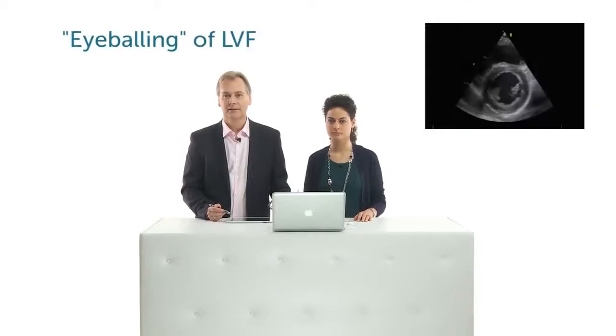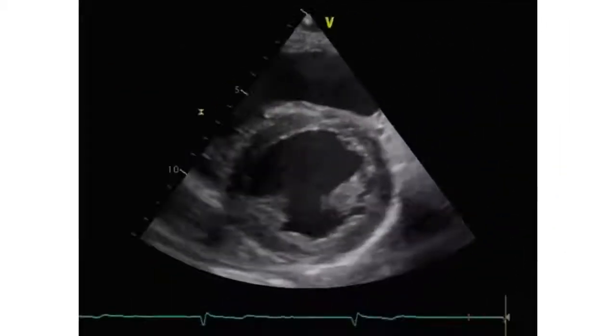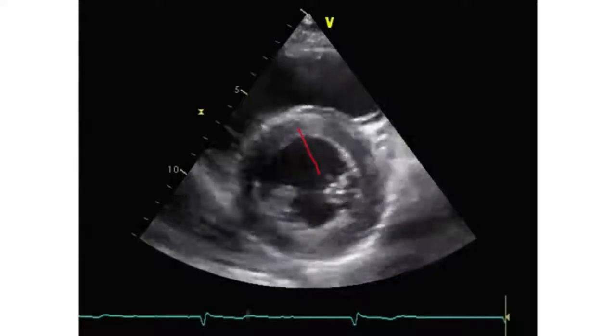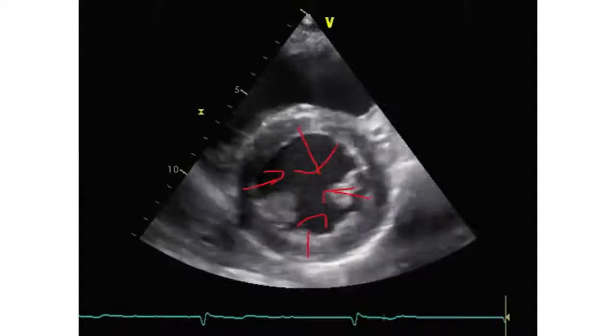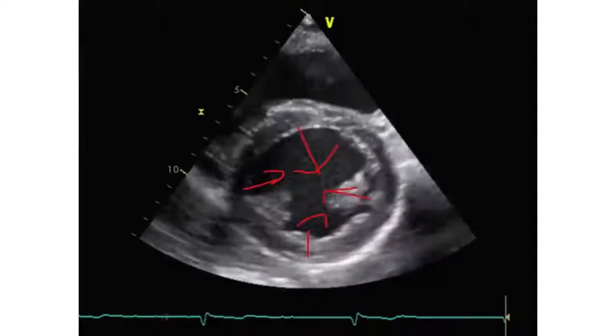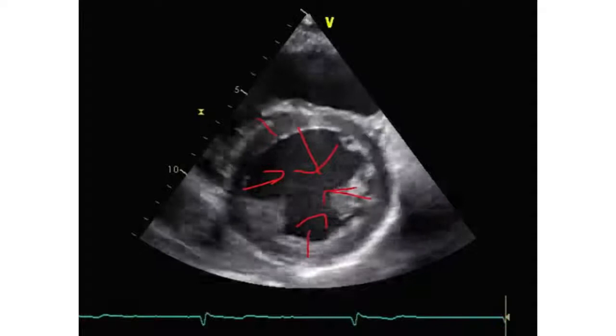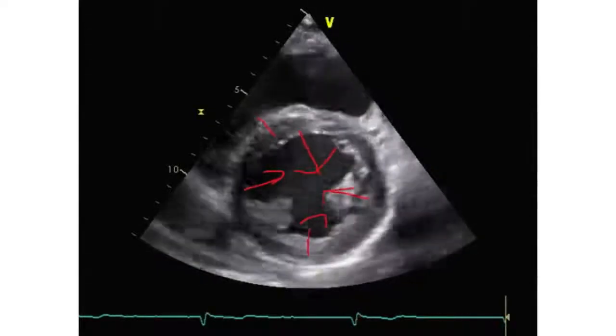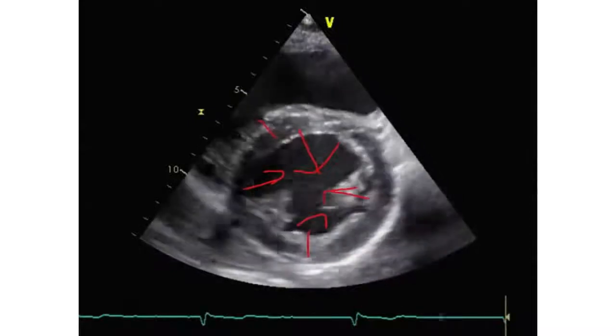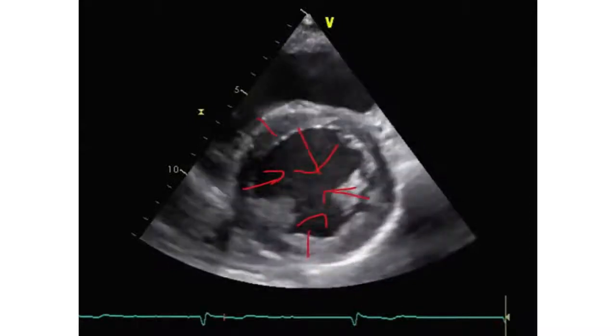We will now show you how to quantify left ventricle function just by looking at it — eyeballing. But to correctly assess left ventricle function, you have to know a few little tricks, and we'll show you what you should look for. First of all, you need to look at the inward motion of the ventricle on all sides. The next thing you look at is the thickening of the myocardium — notice that the myocardium gets thicker while it contracts. These two things are the principal criteria that you should be looking for in a short axis view.